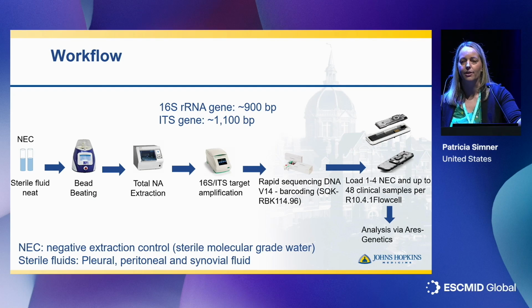We have a negative extraction control that goes through the entire process. We also have a positive control that goes through the process as well. The negative extraction control is very important because we need to assess what is clinically relevant and interpret those to report to the patient chart. There's background nucleic acid in everything, so you need to understand what is significant versus not.